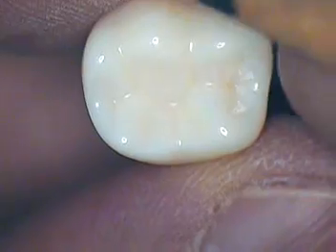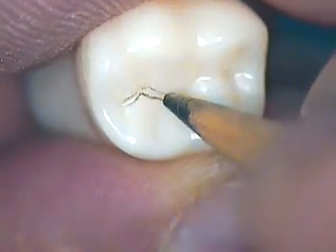Hello, this is Dr. Jerry Cuomo here with the Class 1 tooth preparation on number 19. Let's start by outlining the primary anatomy of the central groove.